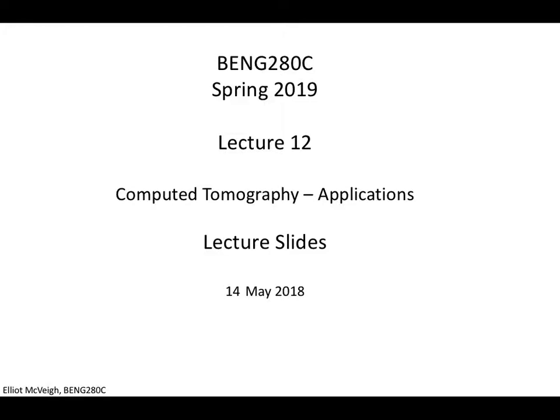Okay, so we've covered the basic technology and physics of CT last week, and so now we'll look at some applications in cardiology.